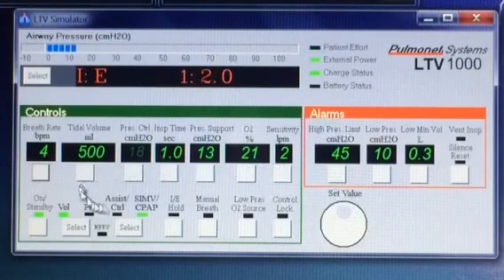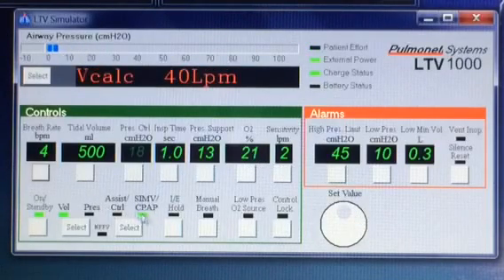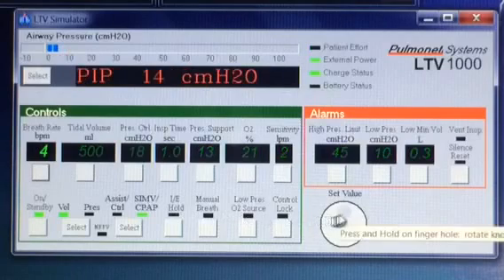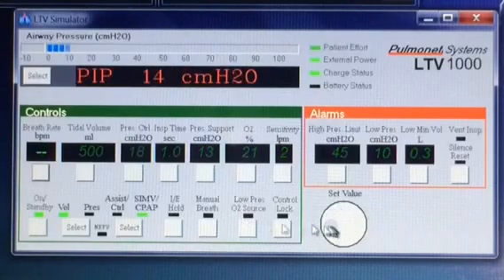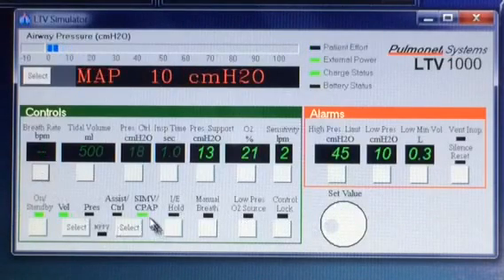On this ventilator, the way we get them into CPAP mode is by simply turning off the breath rate — turning it to zero. Now we're in CPAP mode.